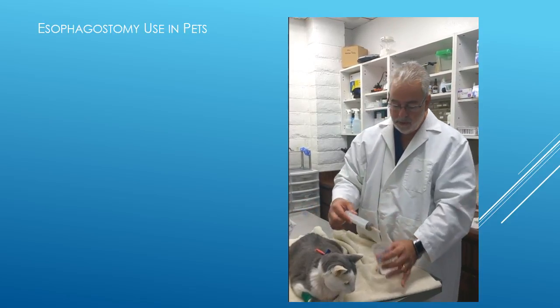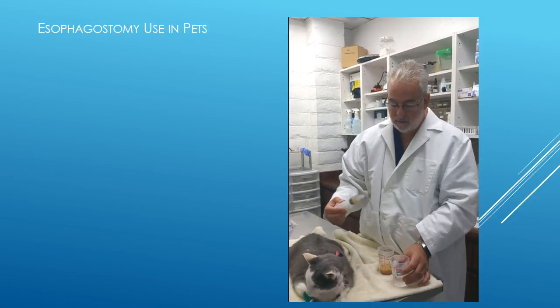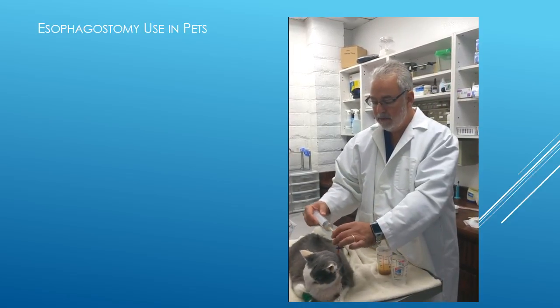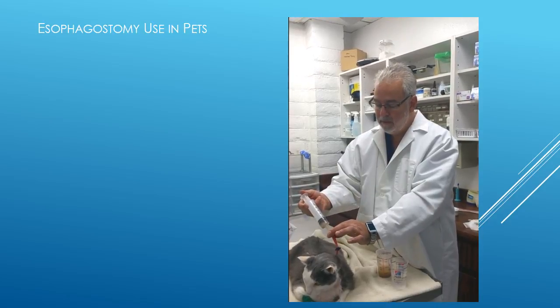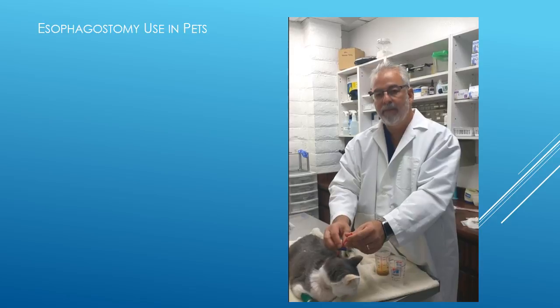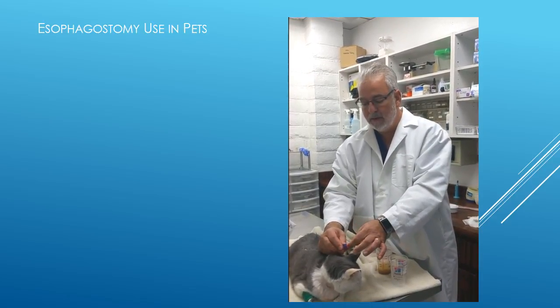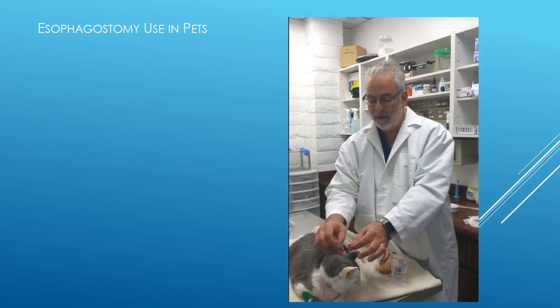Once we're done with the food, we're going back to our water. We're going to take another 10 cc's of warm water, introduce that back into our tube, and flush that through, so we know we're not leaving any food in the tube. Once that's complete, we're going to push this clamp back over the tube so that it cannot have water coming back.